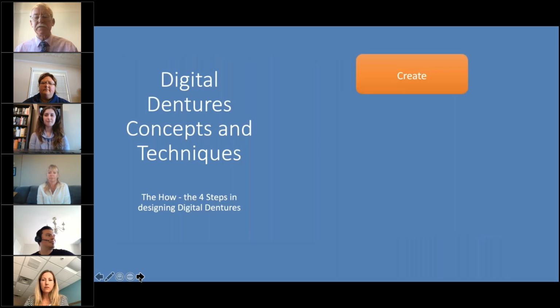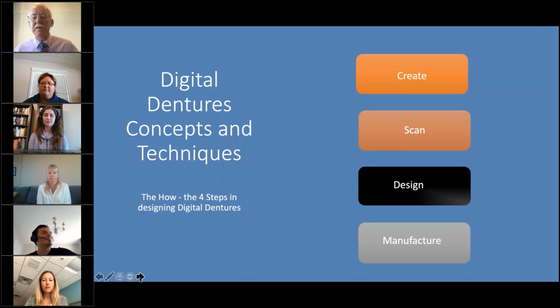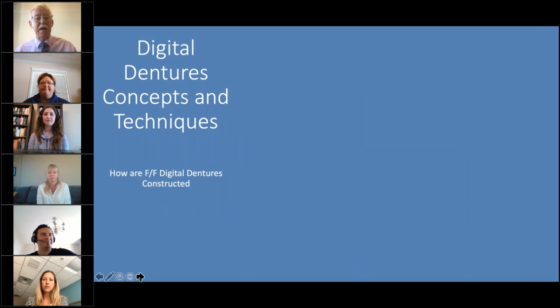So the 4 steps of doing a digital denture: this is the one slide that I'd like you all to take away. If you remember, you've got to create, scan, design, and manufacture. And this is a webinar in itself, but how to do it clinically.